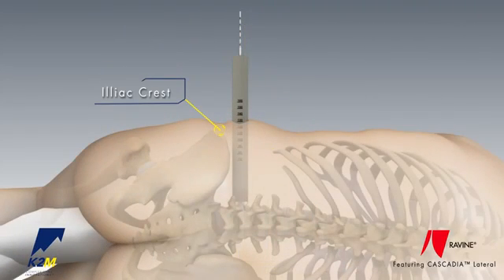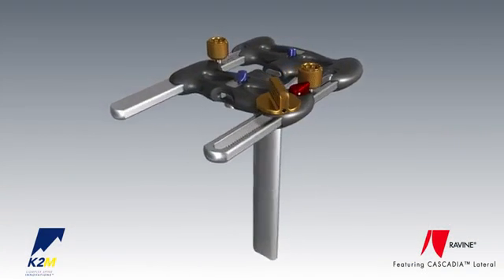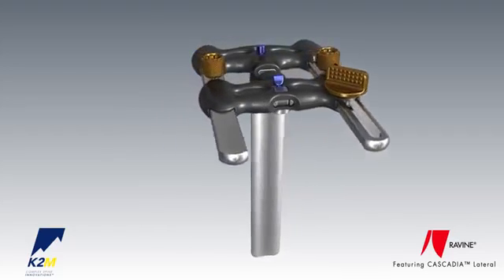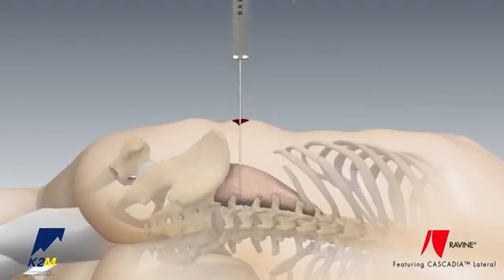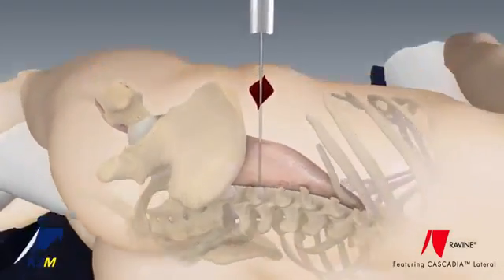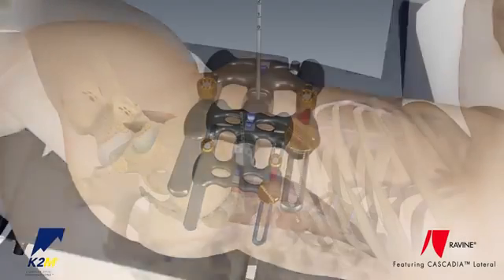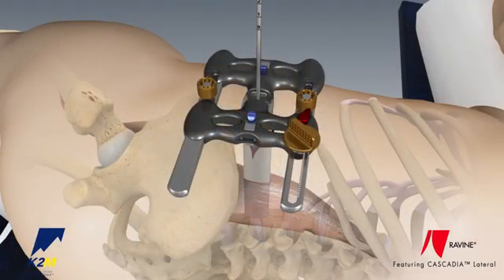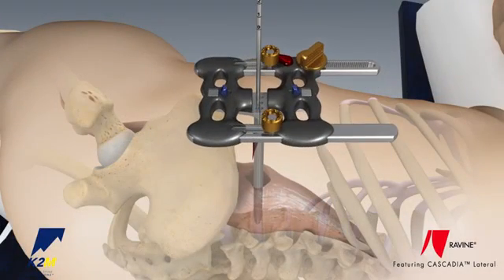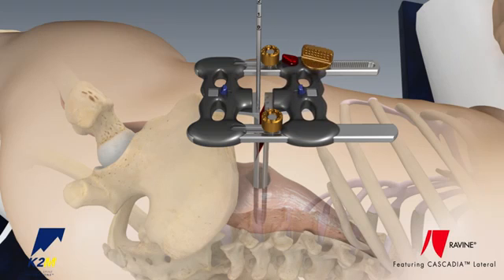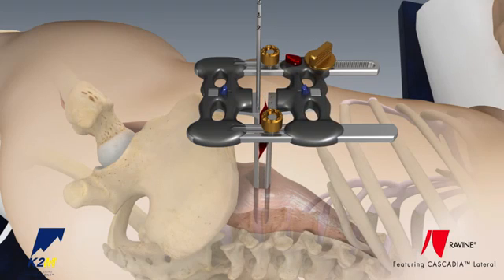Blade length is determined by any one of the dissectors in relation to the skin level. Once the Ravine Lateral Access retractor is assembled with the appropriate sized blades, the dissector is removed. The retractor is introduced into the same safe corridor by capturing the guide wire in one of the 6 desired blade channels. The Ravine Lateral Access retractor is then rotated 90 degrees so the orientation of the blades is in line with the end plates.